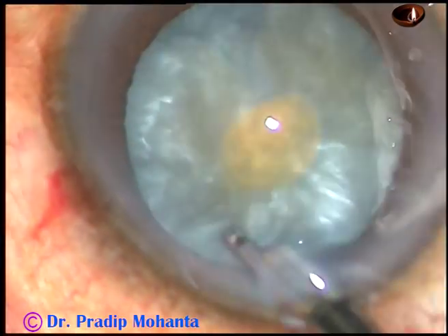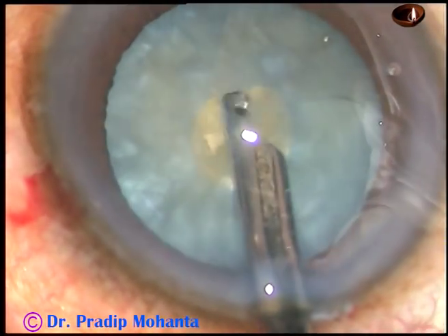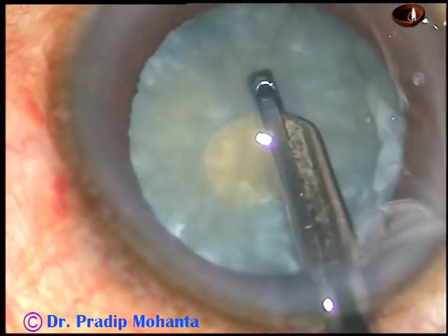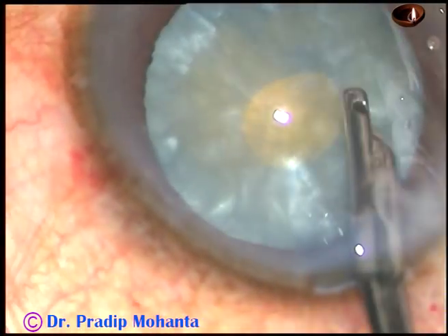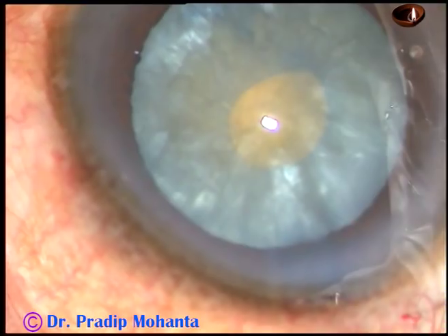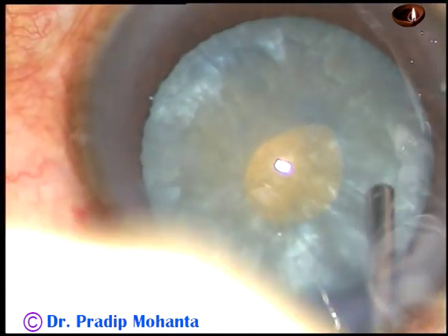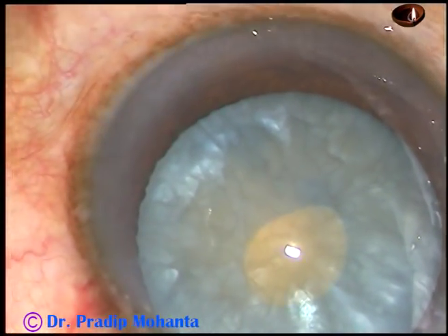Squeeze the lens matter from the periphery, bring it to the center and aspirate it. I am squeezing it from the periphery over the anterior capsule, bringing it near the center and removing it. Thus decrease the intralenticular pressure in all quadrants. In this case the sub-incisional area is not totally decompressed, but it can still be managed because the intralenticular pressure has decreased drastically.